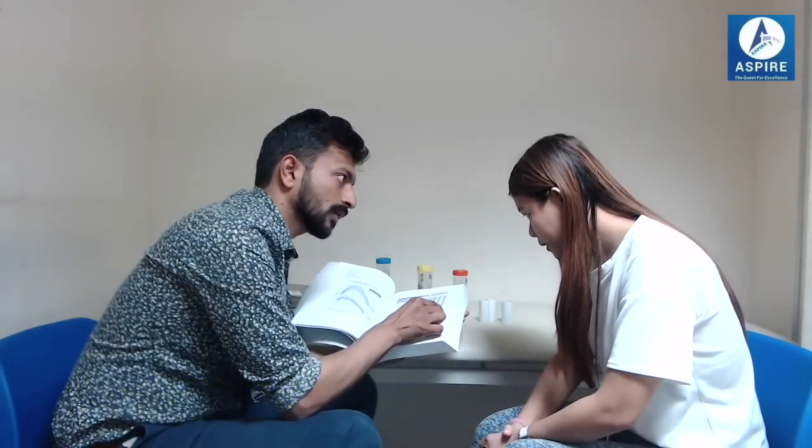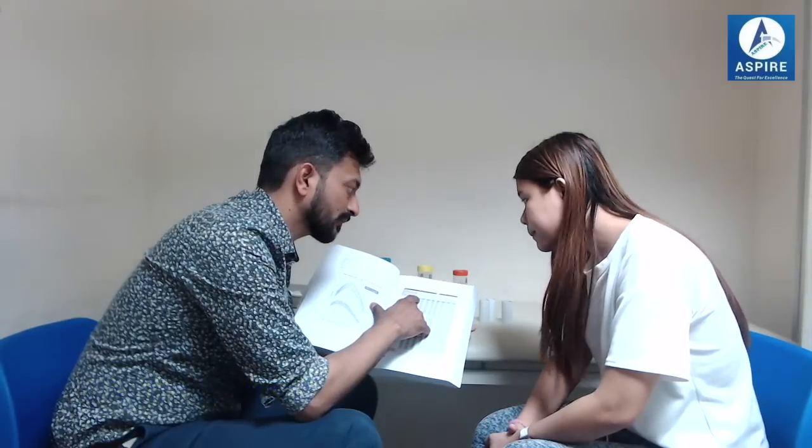We give this asthma diary to our patients. This asthma diary is used for two weeks. It's written Monday, Tuesday, Wednesday, Thursday, Friday, Saturday, Sunday — so this is for one week and this is for another week. Here you can see it's AM and PM readings — morning and evening. As we discussed, you take three readings in the morning, three in the evening, and plot the highest one on this graph.